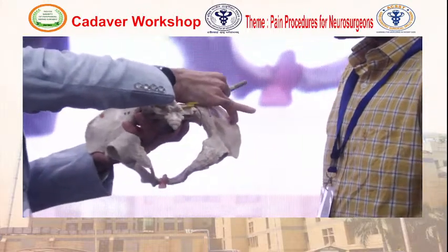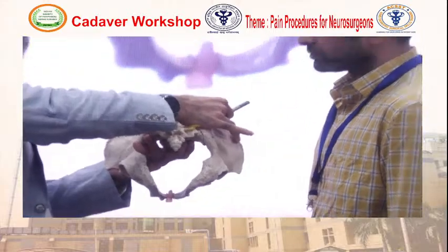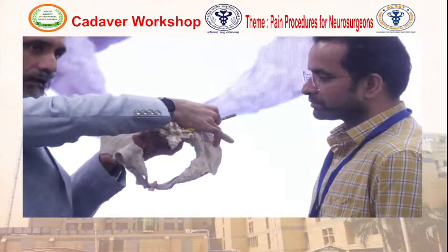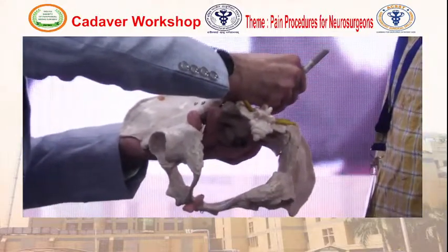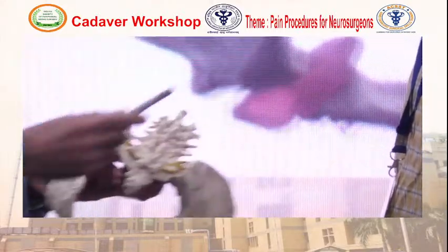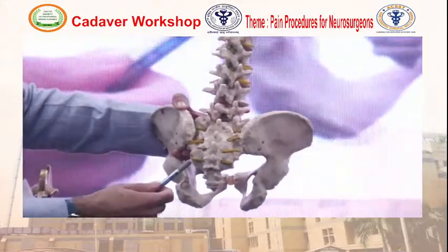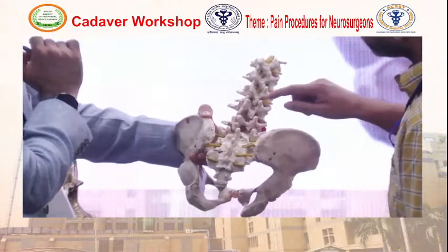So this automatically changes the neck, and if we have to do this, he will have to bend like this. Here, if it is a facet, it will be like this. So if you position the camera a little like this, yes, you're showing the position. So this is this.